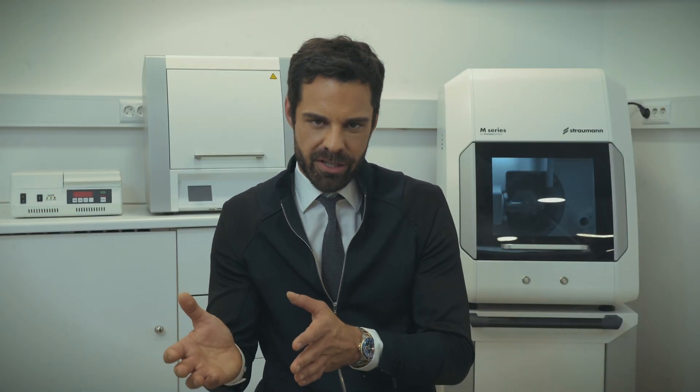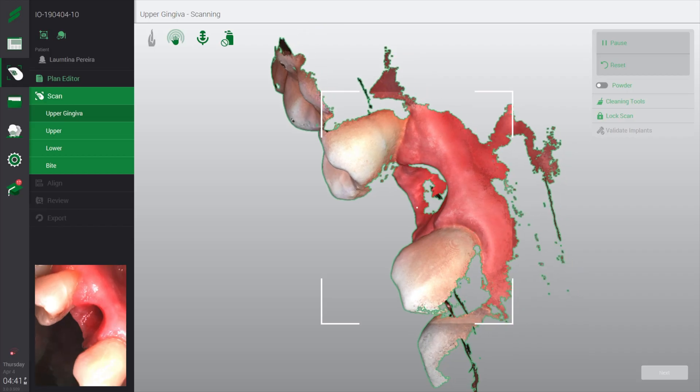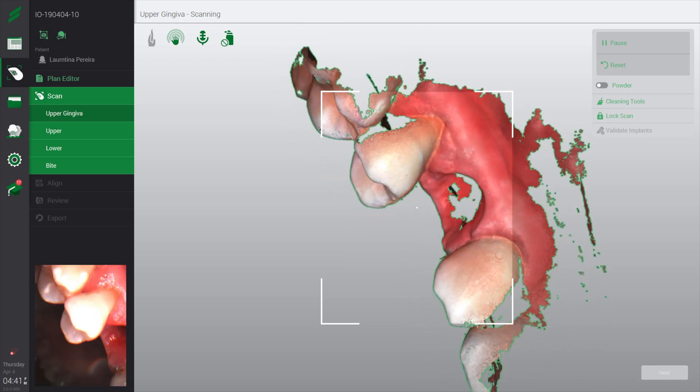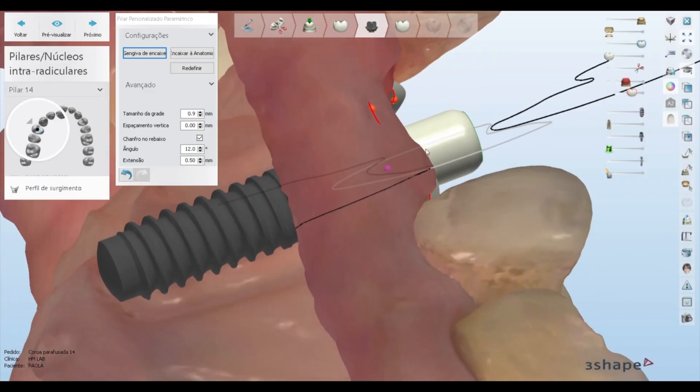So what are the steps from the beginning until the final restoration? First, we start with the impression — with an intraoral scanning of the patient situation or with a conventional impression scanned with the lab scanner. Once the design is completed, we can directly transfer it to a milling solution of our choice, either in lab or at a centralized milling center. We open the STL files and the magic begins. We start to design the restoration, the personalized abutment with the indications and what we expect for our final restoration.